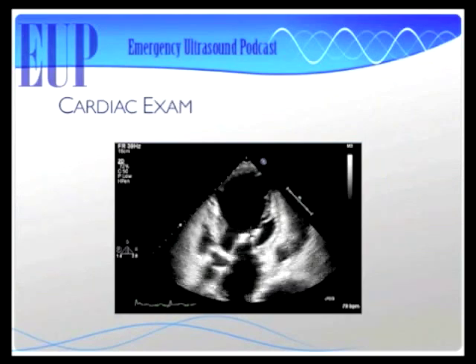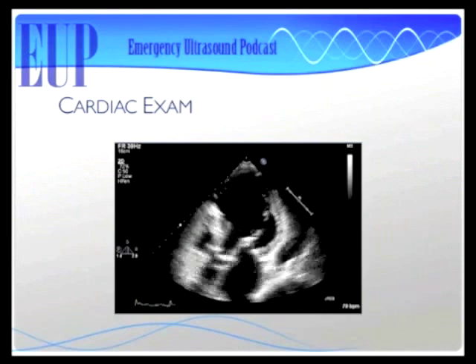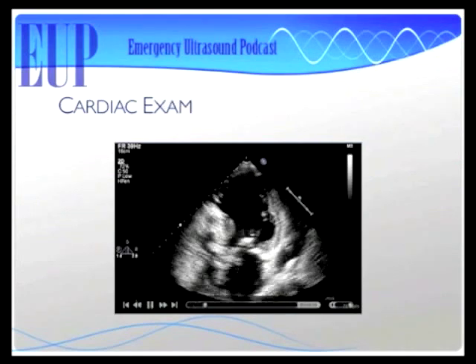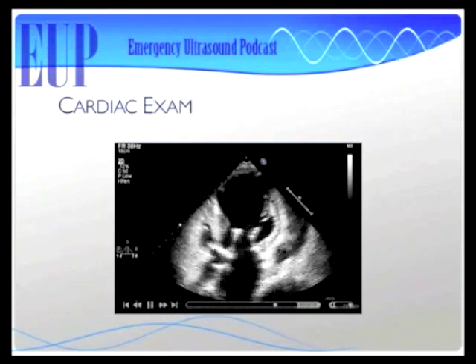Yeah, I thought you were talking about a different heart. No, just this one. Okay. So this person has what looks like probably an LAD lesion, and then maybe even some circumflex lesion too, because they've got some lateral wall abnormalities too. Well, sure, an LAD lesion. I thought you meant something significant.